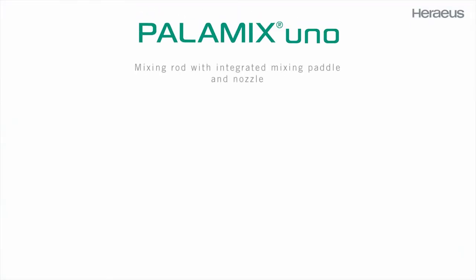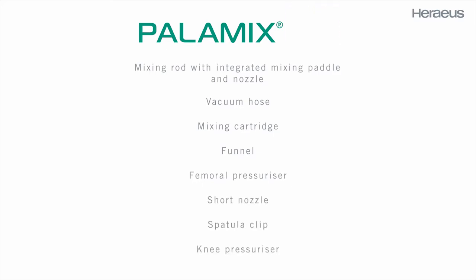The Palomix Uno system contains one mixing rod with integrated mixing paddle and nozzle, one vacuum hose, one mixing cartridge, one funnel, one femoral pressurizer, one short nozzle, one spatula clip, and one knee pressurizer.